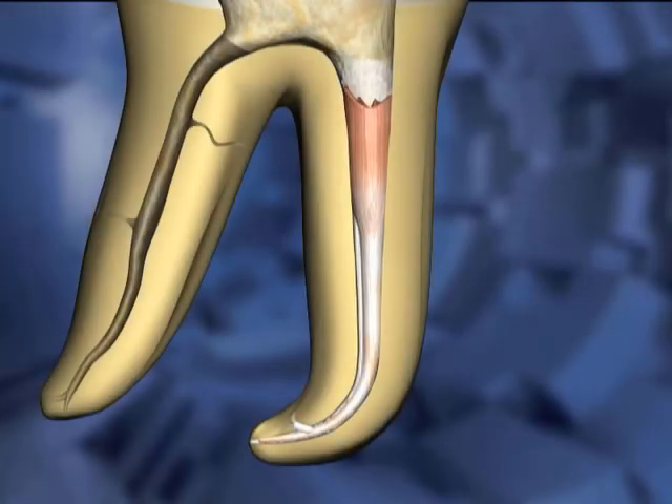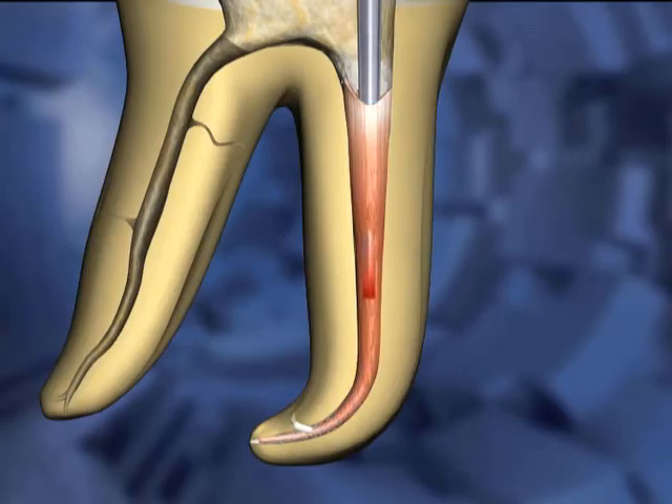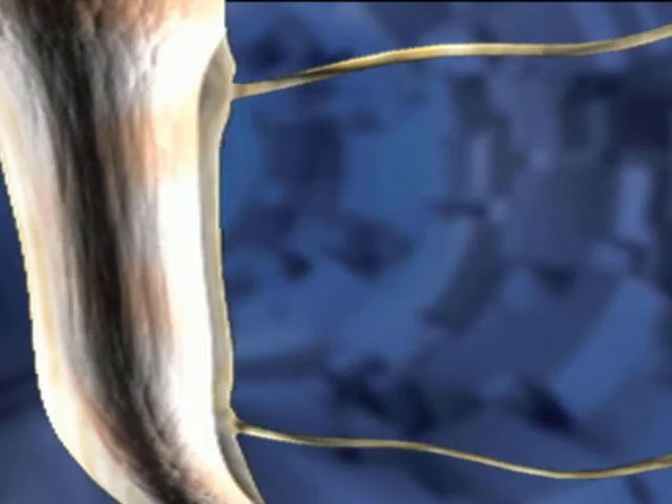In a continuous wave down-pack technique, the heat carrier is inserted into the gutta-percha mass. Color changes indicate where the gutta-percha is changing temperature and being thermosoftened. The heat is kept on as the carrier is pressed further and further into the gutta-percha mass.